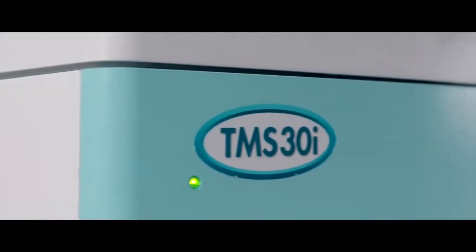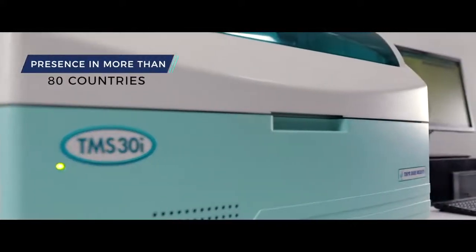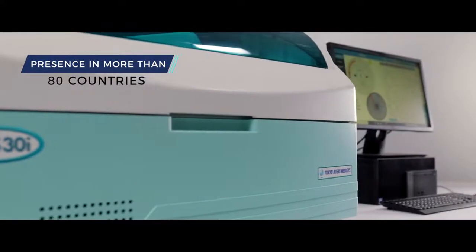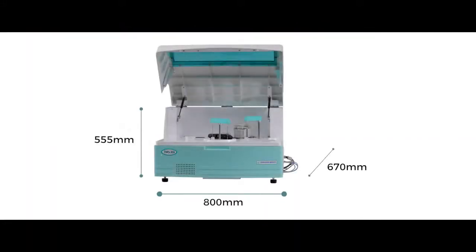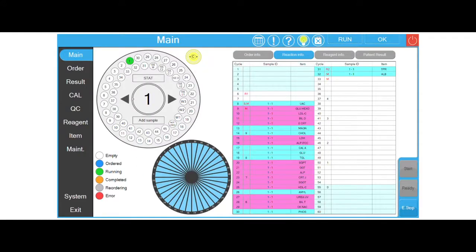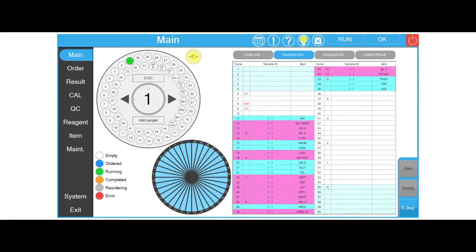TMS-30i, a fully automated biochemistry analyzer, the one and only perfectly designed diagnostic tool for speeding up clinical laboratories. This model primarily solves space constraints for any laboratory. TMS-30i offers constant 270 tests per hour for photometric throughput.